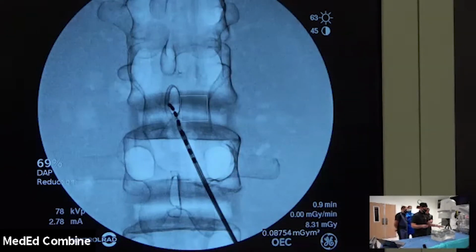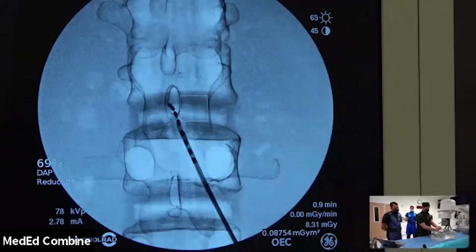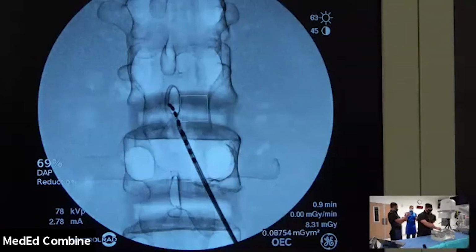But what you're going to do is drive it up to wherever your rep tells you, somewhere around the T7 to T9 level, usually a right and left. And then as you would, come out with just your needle. So I think that's a good question for a lot of people that don't do SCS yet. Does it matter? Is it ever different with DTM? Or do we always put it in the same spot?